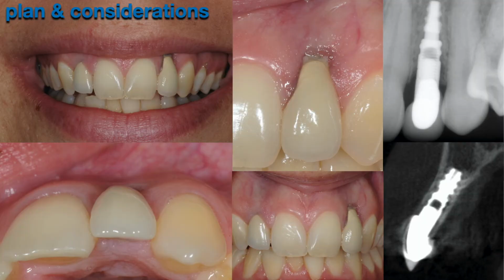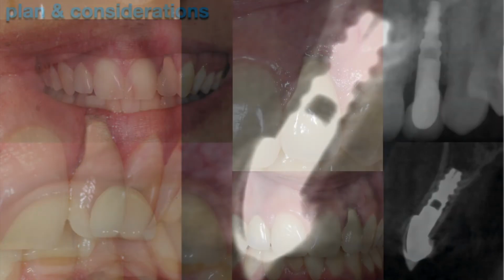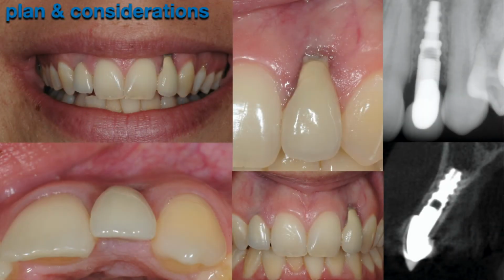But there are a couple of surgical things to note. Surgically, this implant is placed perfectly between the buccal and palatal corridor. But restoratively, it's not working for me, too shallow. You can see on the CBCT there is really good, adequate palatal bone, an abundance of it. And that will determine what our treatment options are going to be. So really the challenge for me was how to regenerate the soft tissue and bone and replace this implant. We'll talk about some of the treatment options that we entertained.